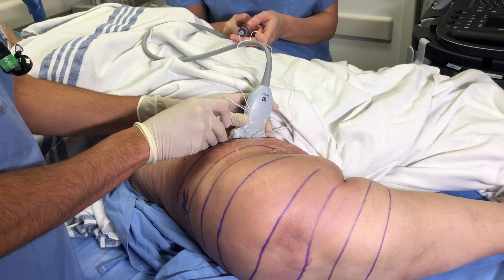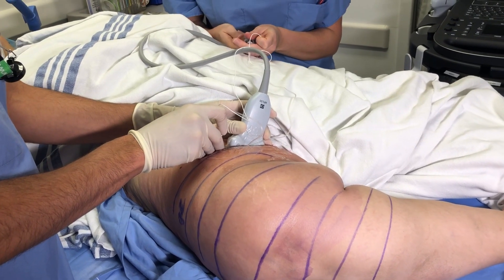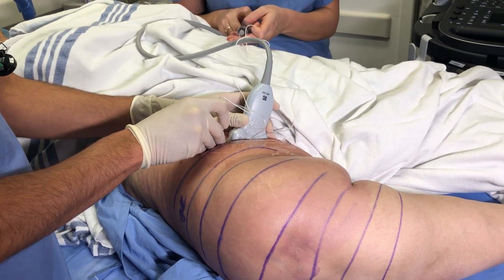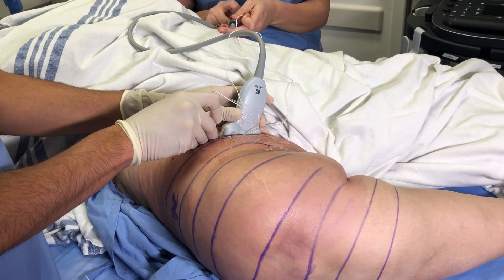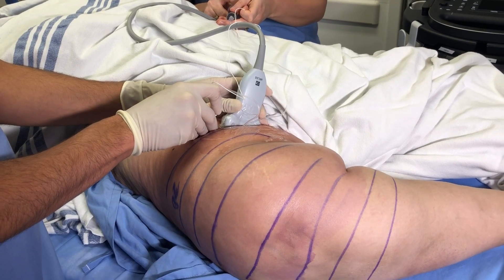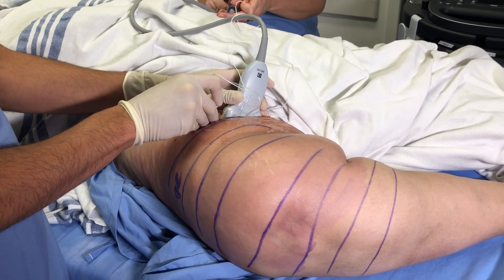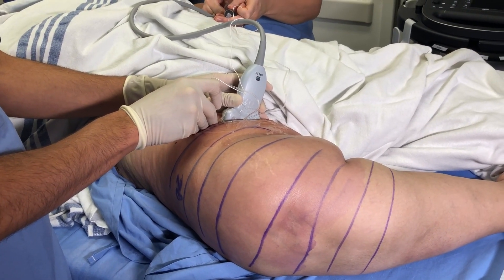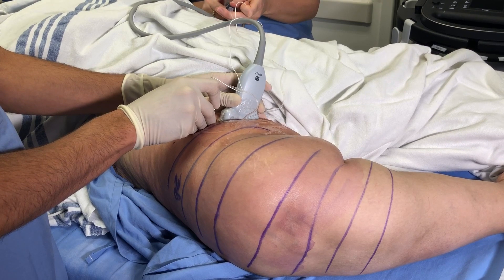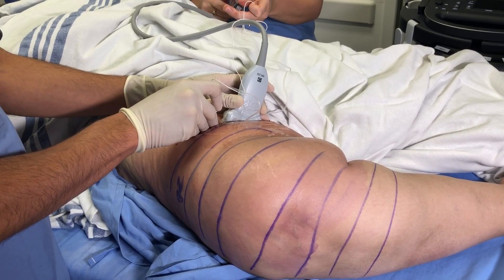The ultrasound device has really made this a much easier procedure. That's correct. Now we have much better visualization of various anatomical structures, such as the muscles, the arteries and veins.